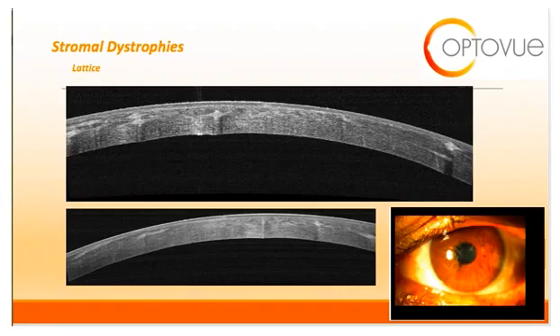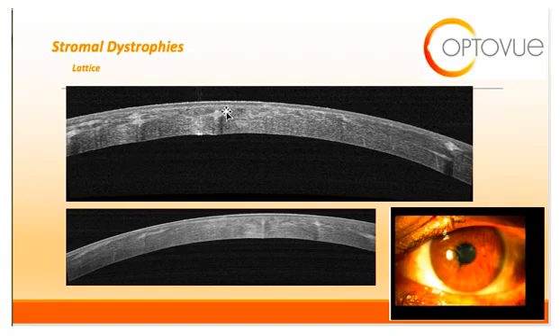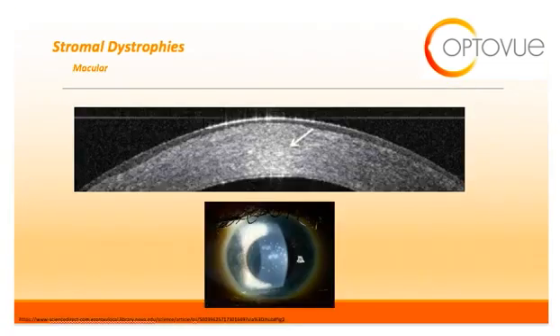Next is lattice dystrophy. Lattice appears clinically as refractile branching lines, white subepithelial dots, and can lead to eventual scarring of the corneal stroma centrally. On OCT, you can clearly see the linear hyper-reflective lines correlating with this dystrophy.